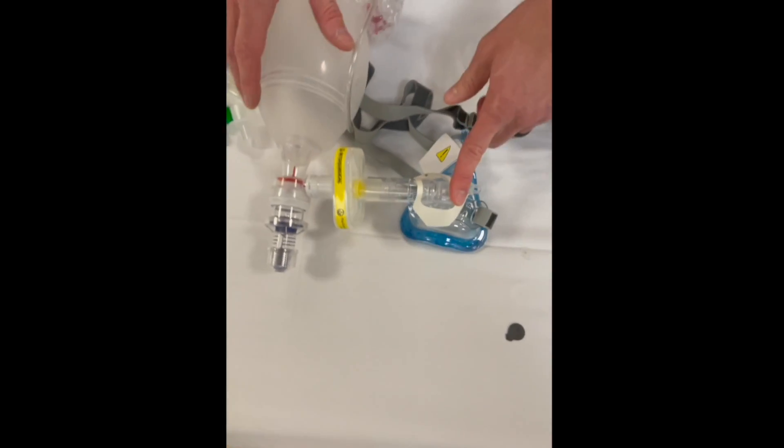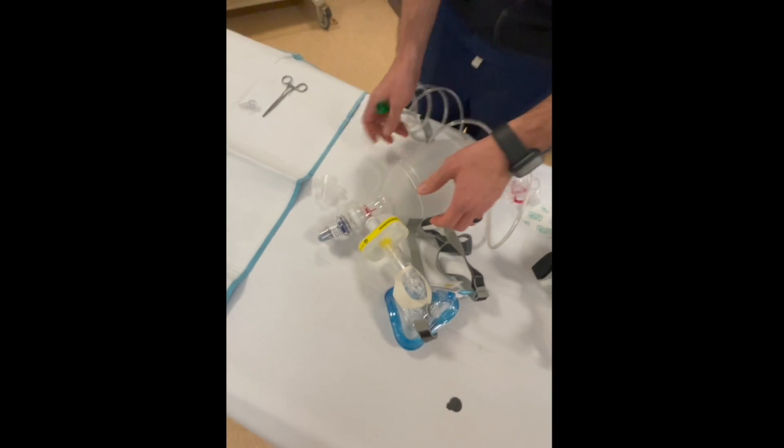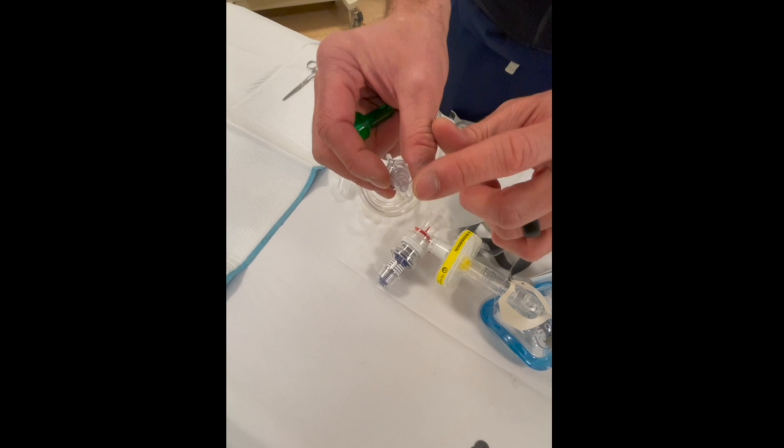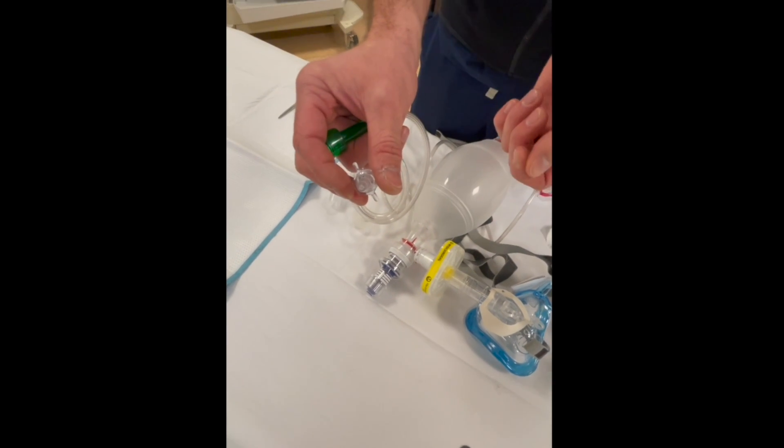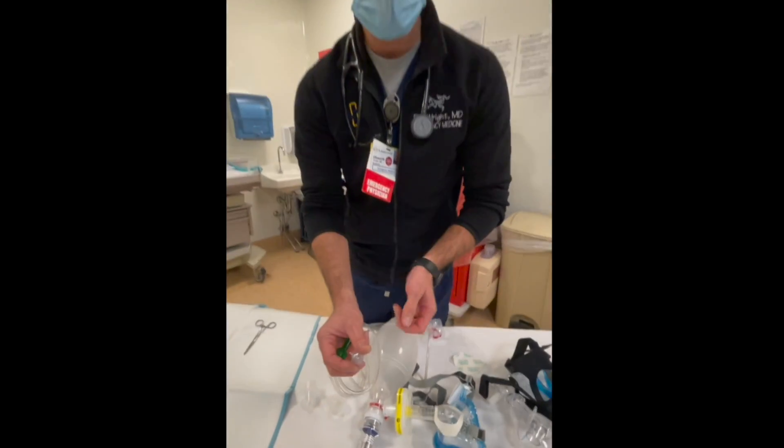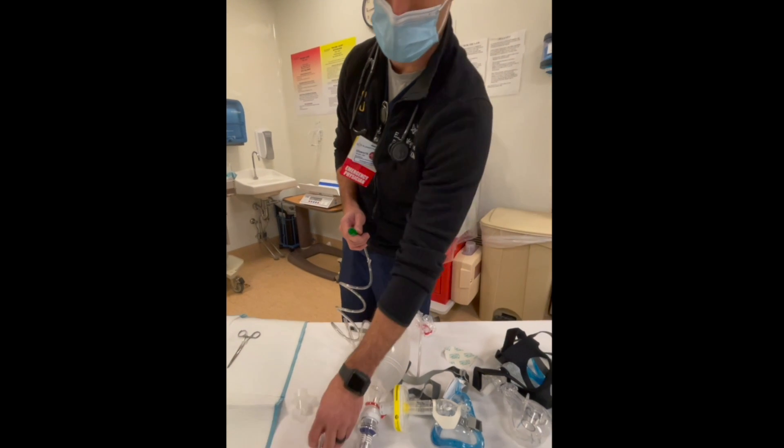After we hook this up, we are going to hook it up to oxygen. I actually like to take the Christmas tree off because it's going to decrease our flow. Most of the time we're going to put this on flush rate, so we're trying to get the most amount of mean airway pressure that we can.